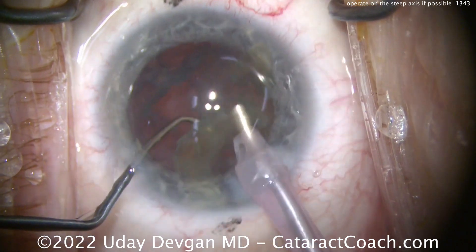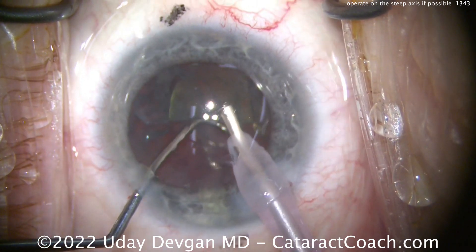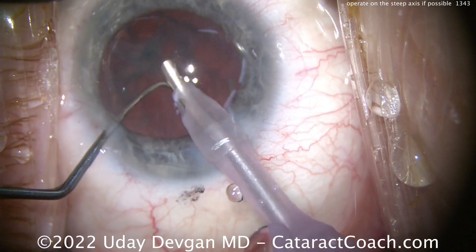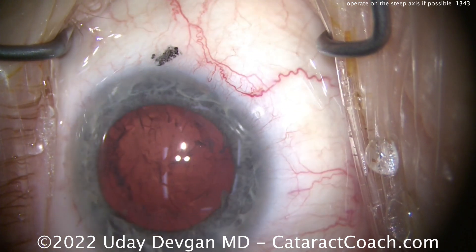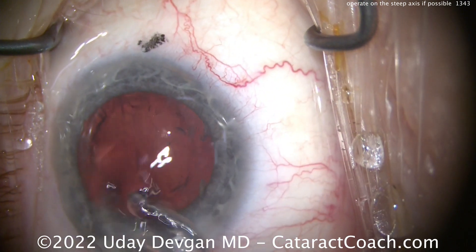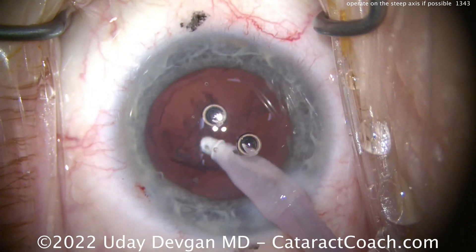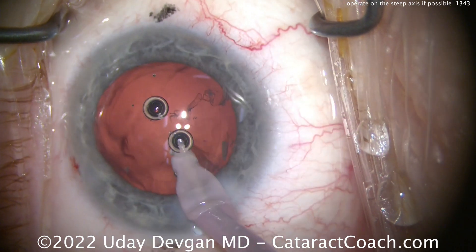It's a good habit to have, especially as you look toward refractive outcomes or toric lenses. Say you're doing a toric lens and the patient has a significant degree of astigmatism — a diopter and a half — placing your incision on the steep meridian will actually help. If there is a variable response to the incision, it'll just change the magnitude of the astigmatism and not its direction. Placing your incision on an oblique axis — oblique to the steep or flat meridians — can really throw things off and make the refractive astigmatic outcome less predictable.